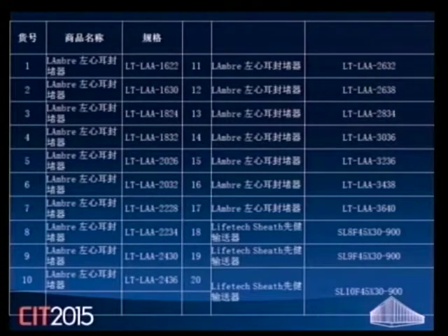We see 11 to 20. So here the higher number is missing. So we will choose 2834. 28 is the size of the umbrella. 28 is an oversizing over the highest diameter of the orifice of 24 millimeter.